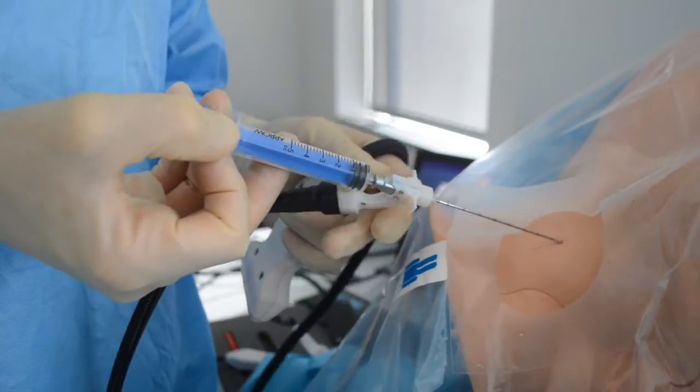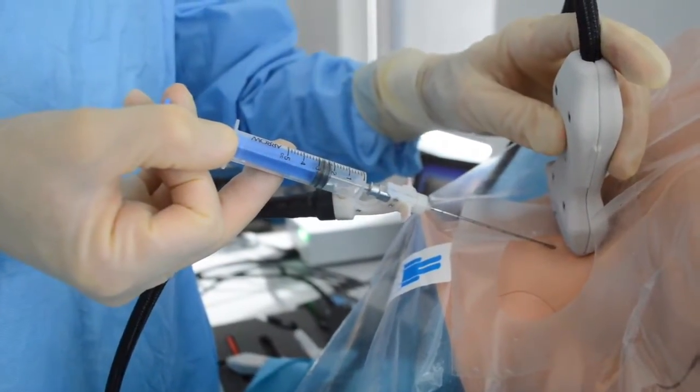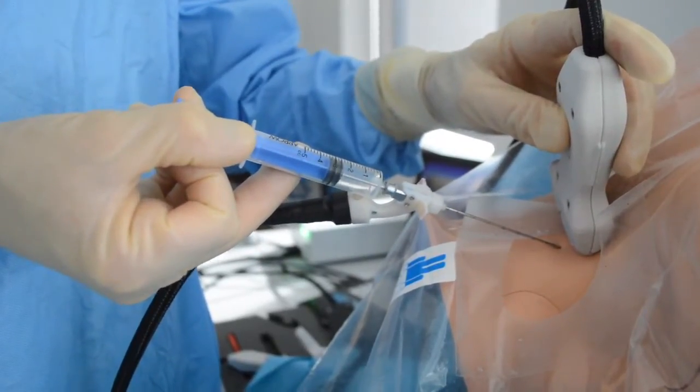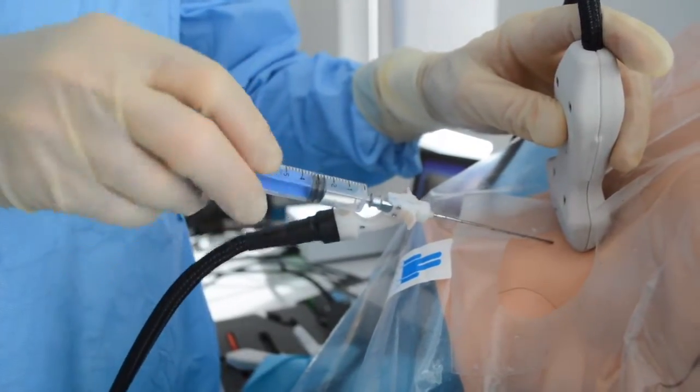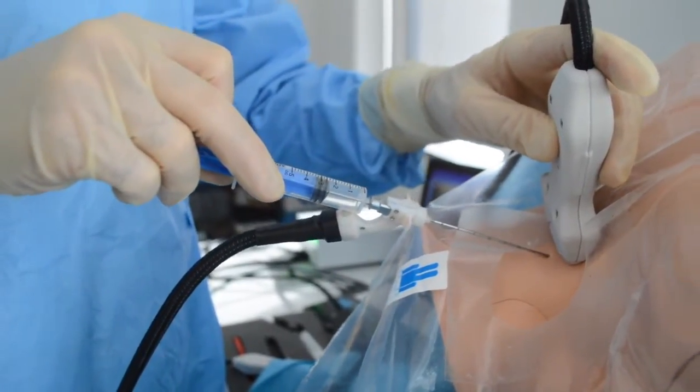In order to do this, you should orient your fingers to be around the plunger so you can simultaneously advance the needle while holding gentle traction on the syringe's plunger. You can do this with your hand underneath, on the top, or even on the side.